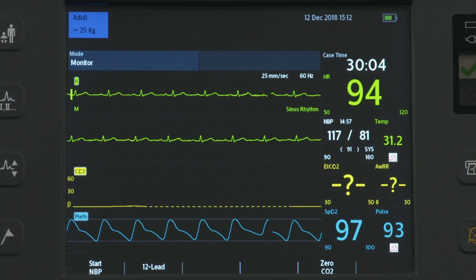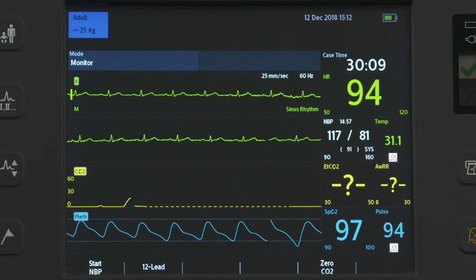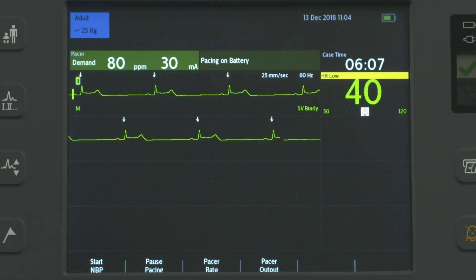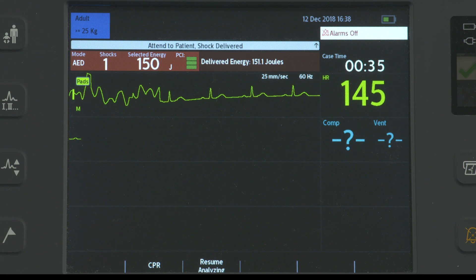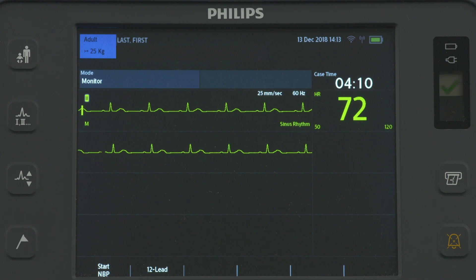The HeartStart Intrepid is configured to populate each wave sector with a predetermined waveform when powered on in monitor, manual defibrillation, pacing, and AED modes. Wave Sector 1 will only display an ECG waveform, which is used by the arrhythmia, heart rate, and AED analysis algorithms.